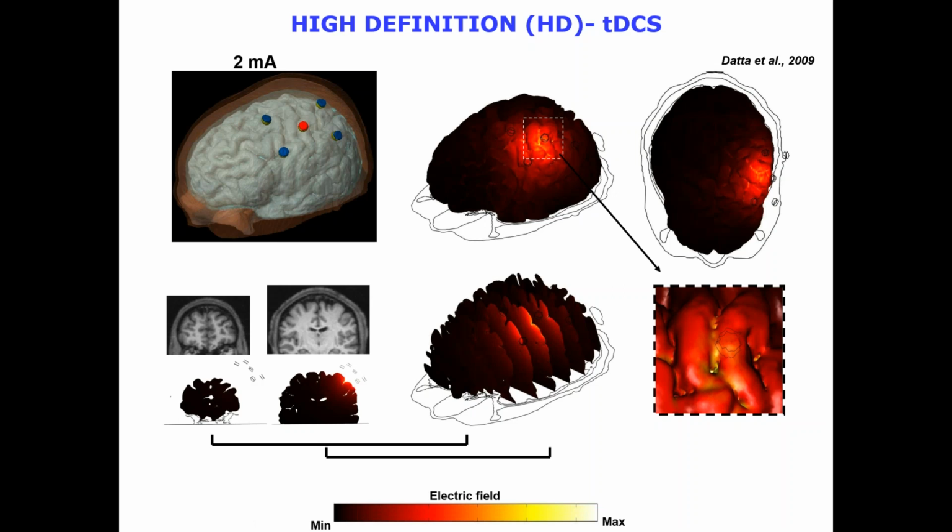In a typical protocol, they may do that 8 times in a row. Let's say within a couple of weeks, they may do that 8, 9, 10 times. And we do that for a number of reasons. One, we're constantly evaluating: did we change those hubs and those connectivities? Even though we have a lot of nice tools to image and to tell us how to set up a particular montage, a treatment protocol, you still have to look and see: did it really hit? Did it really work? Sometimes that takes a session or two, and then you'll make the changes.